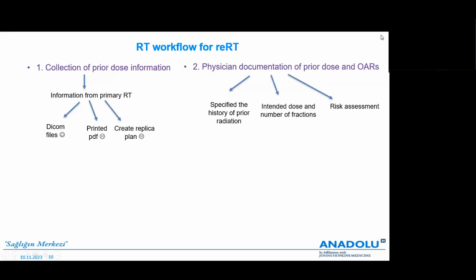And then they should think about the risk assessment. So they think that this second radiation will be feasible, and they will think that this will be beneficial for the patient and with low toxicity. This is another important thing.